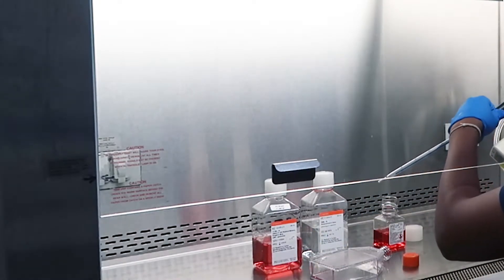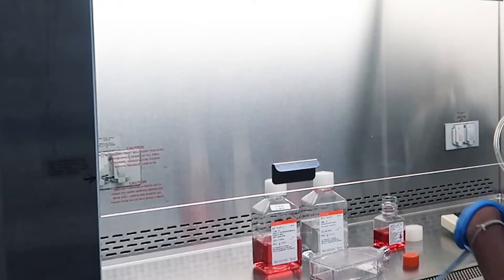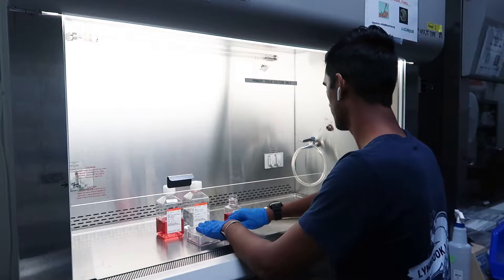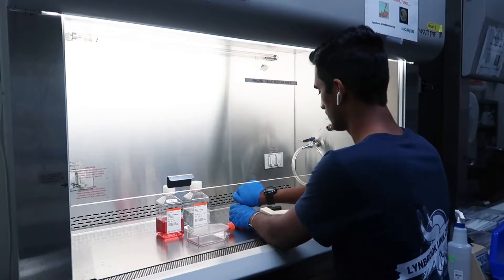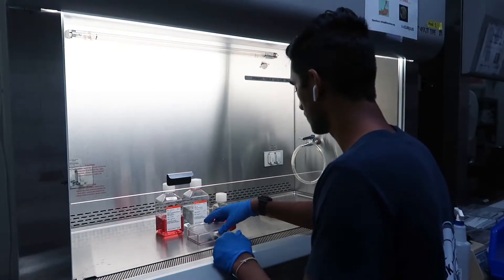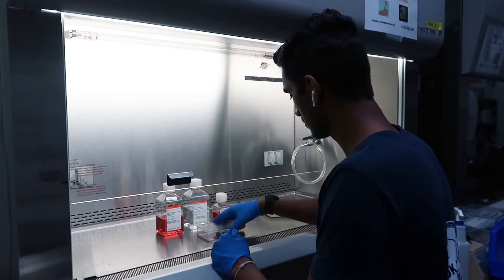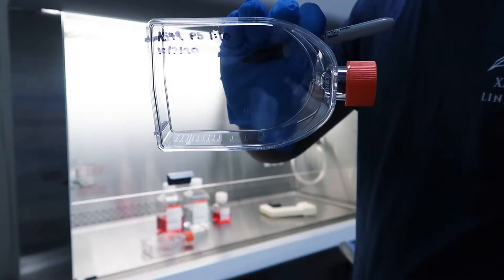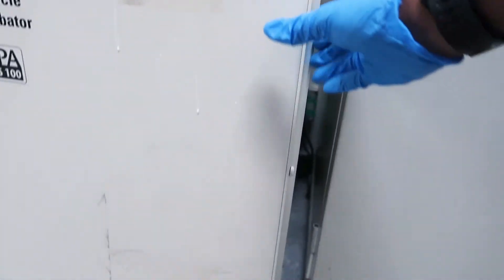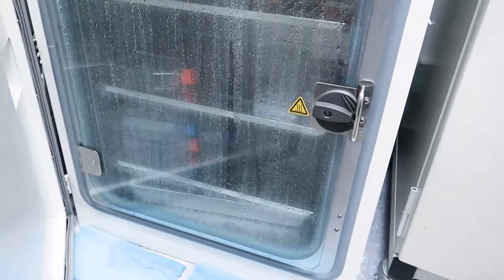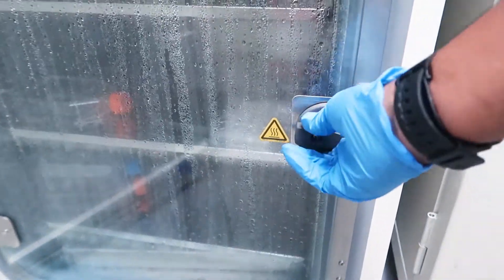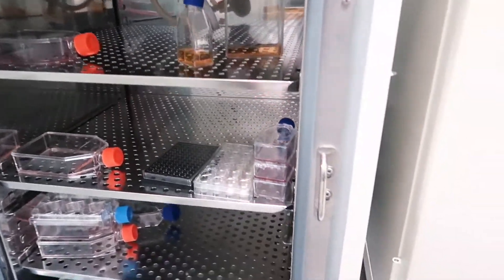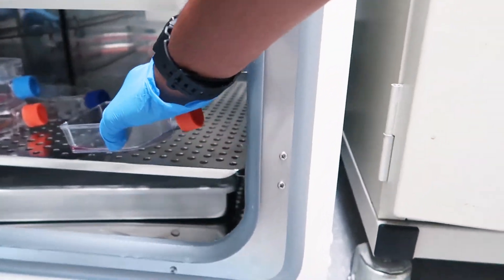Once you add your trypsin EDTA, make sure that you swivel your flask so that your trypsin like the PBS covers all of the cells. Once you do this, we're going to incubate the flask for three to five minutes at 37 degrees Celsius in the incubator. Now you don't want to leave it too long, but you don't want to force the cells to detach before they're ready. So make sure to leave it again for three to five minutes.